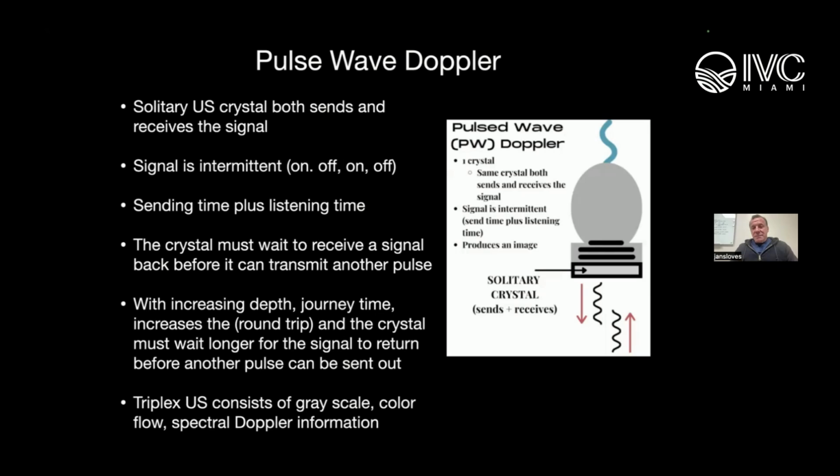Correct. Now, is that the same case with the deep system? Yeah, I feel the same way about that too. So basically, when I'm going to do an exam, I get the patient in reverse Trendelenburg, like 15, 20 degrees. This is where I'm going to get all my compression. At that point, I also get the bilateral common femoral vein waveforms because I'm looking to see if there's any difference in the quality of those waveforms for asymmetry purposes.